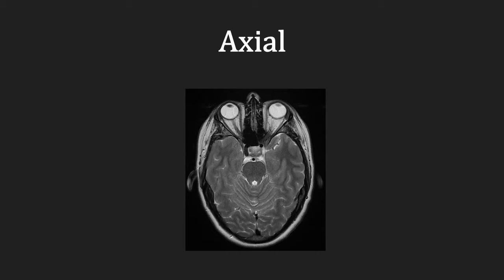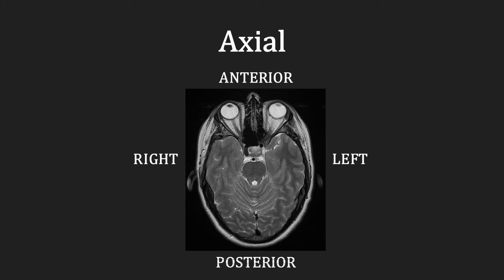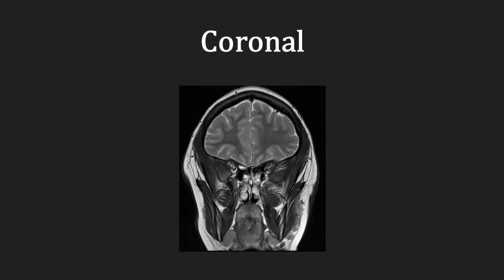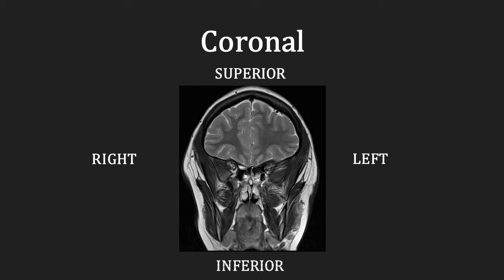On the axial plane, the right of the patient is on the left of the image, whilst the left of the patient is on the right of the image; anterior or the face is at the top, whilst the posterior is at the bottom. In the coronal plane, the right of the patient is again on the left of the image and the left of the patient is again on the right of the image. The superior or top of the head is at the top and the inferior or towards the neck is at the bottom.